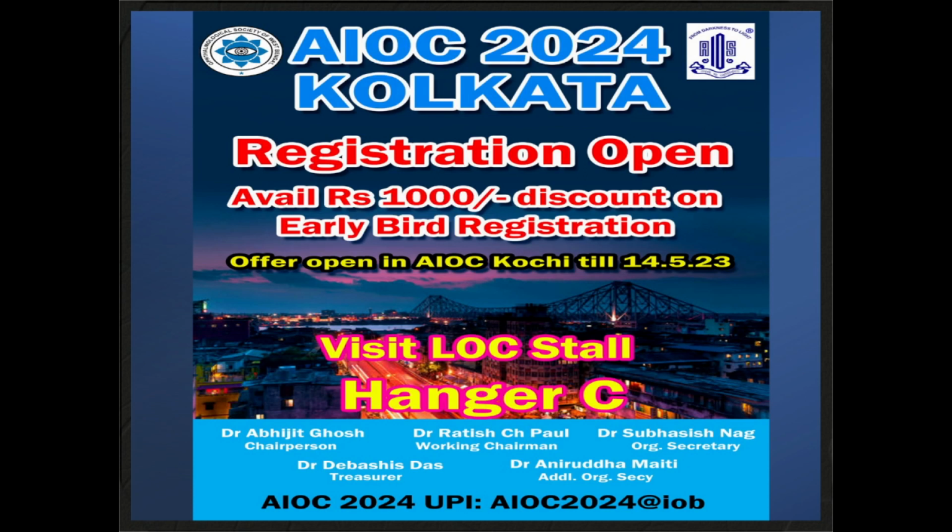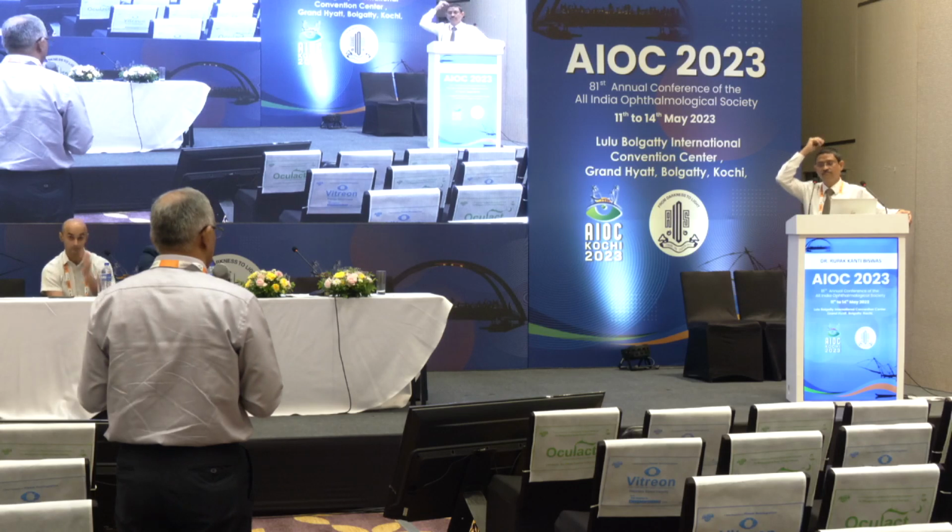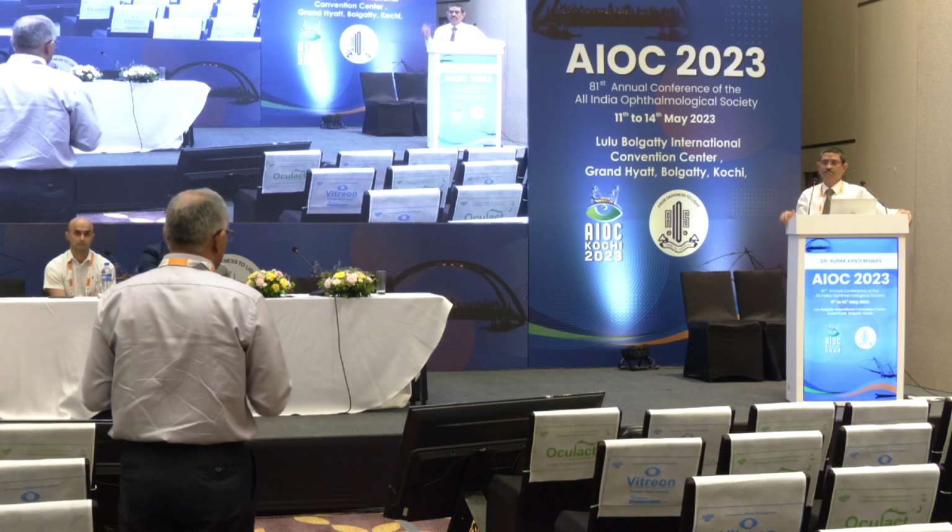I would say congratulations, you got a lucky good result. In these eyes with this blood, some amount of blood is always left. With so much manipulation subretinally, they come back with subretinal proliferation more than pre-retinal proliferation. So recurrence is very high. We can do as clean a job as possible. That is the best we can do, and hope for the best.